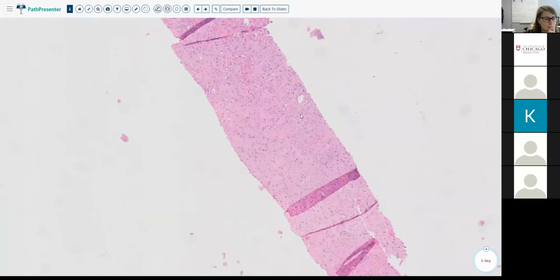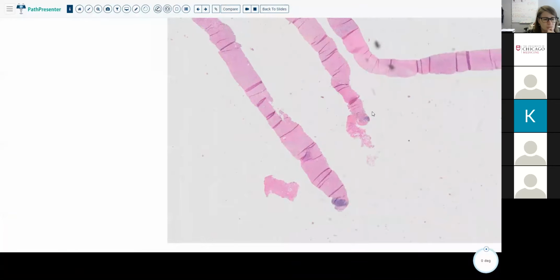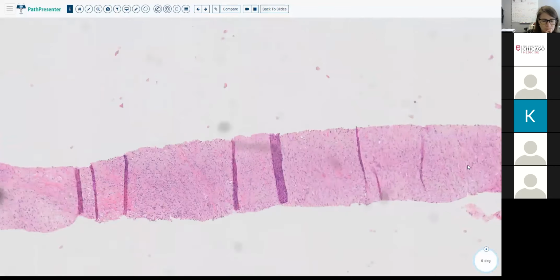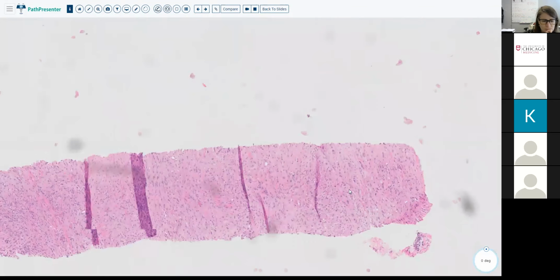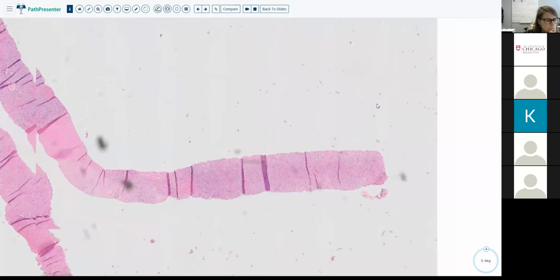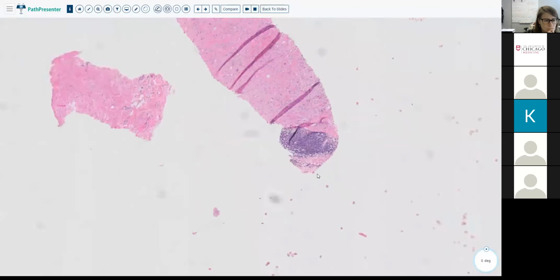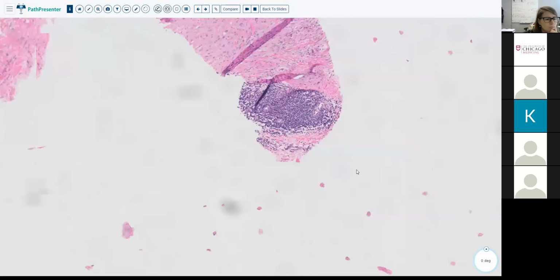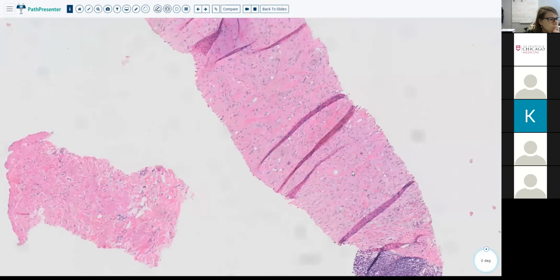Fine. So right off the bat, it's more eosinophilic, right? There's a little bit at the end of two of the three cores that is very blue, and I don't know if that's hitting the lymph node or not. Could be. Yeah, I kind of favor that more as a lymph node. All right, so from medium power here, coursing through it, you have some kind of thick, what seem to be collagenous bands.